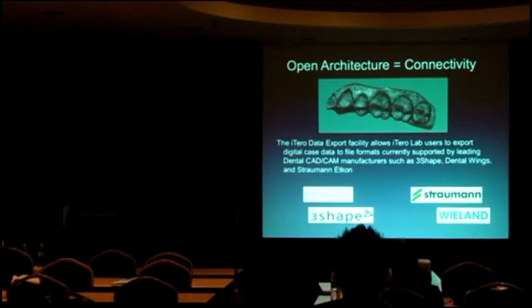The main advantage of iTero is that it's not only taking the data, but it can also work with any other system, meaning open architecture. So when you have STL data with which you can design the restoration on the virtual model, you can work with any other CAD/CAM units. That's a big advantage.